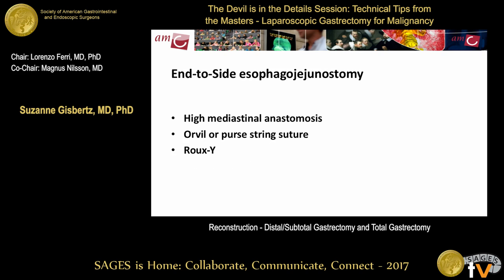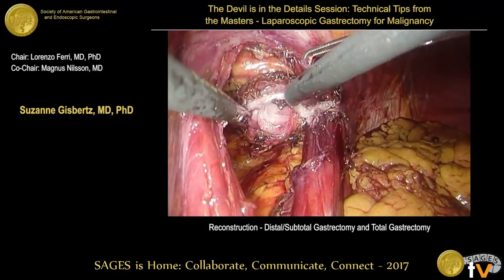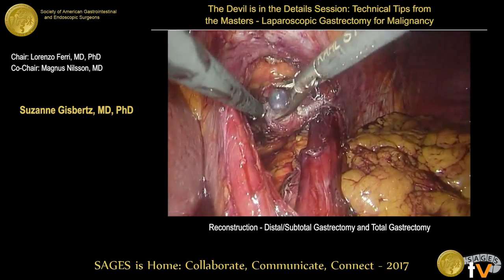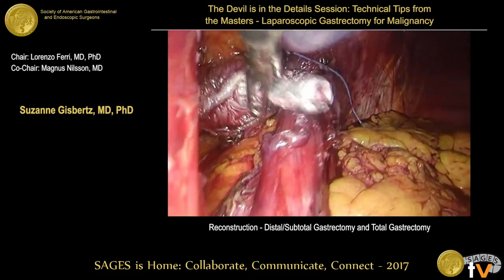For the circular stapler esophagojejunostomy, this is especially suitable for higher anastomoses in the thorax when resecting part of the esophagus. You can either use the OrVil, inserted through the mouth on a gastric tube, or put the anvil in the esophageal stump and fixate with a purse-string suture. In this first video, the distal esophagus is dissected free, stapled with a linear stapler, and the OrVil is inserted through the mouth. Using diathermy, the esophagus is opened and pulled into the abdomen until the anvil is reached.